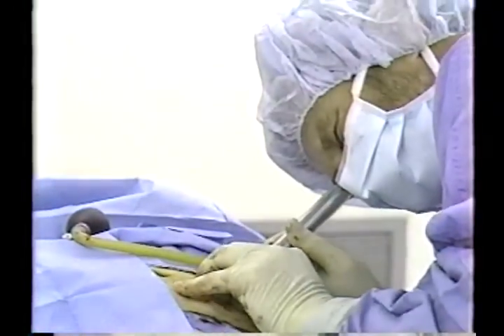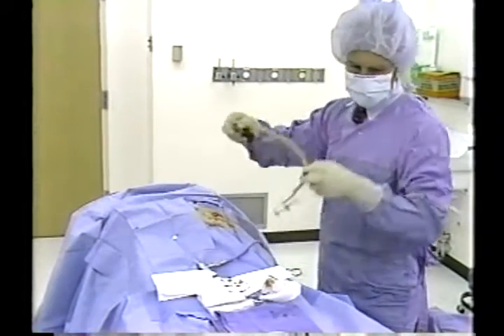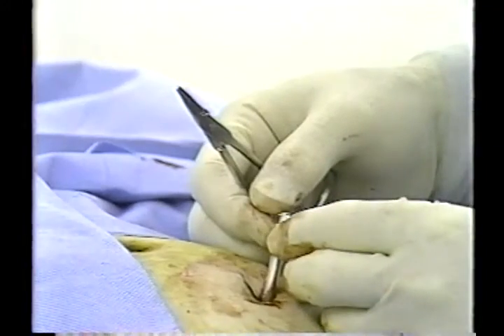The needle scope, cannula, and surrounding quill catheter guide are then advanced into the furthest visible corner of the airspace of the lower abdomen. Adhesions between omentum or bowel and abdominal wall are visualized and avoided. The scope is removed. Intraperitoneal air exits through the catheter guide at this point.